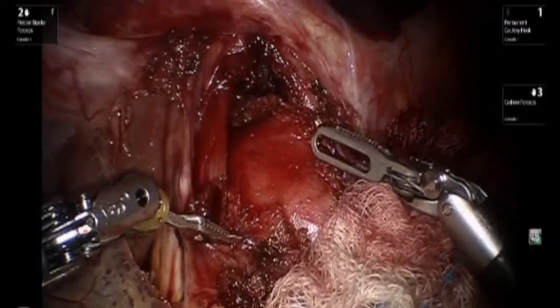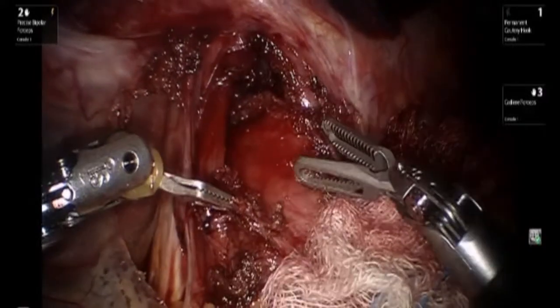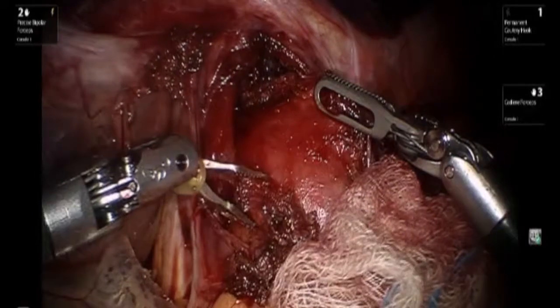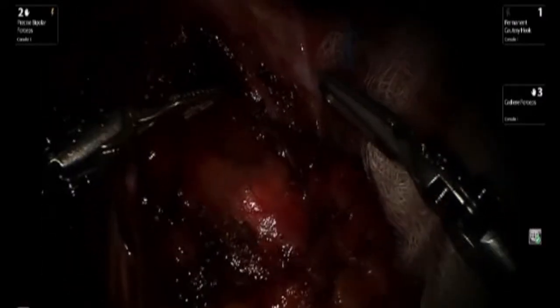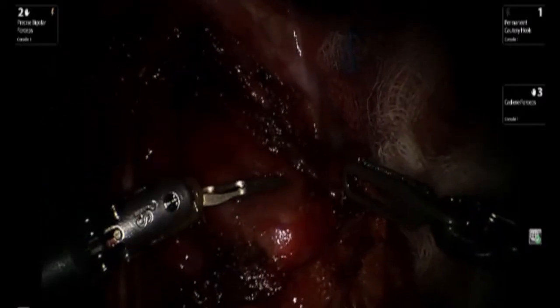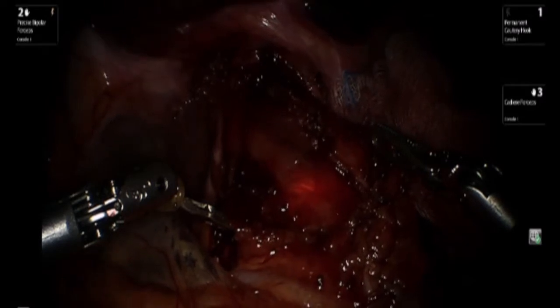Pulling down the cut edges of the myotomy allows one to visualize if there are any further muscle fibers left to be taken down. The surgeon then passes the endoscope, and the goal is to be able to visualize the light from the endoscope, confirming that dissection was adequate and got down to the mucosa.